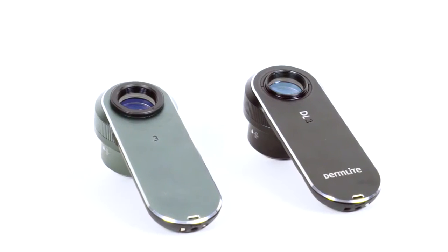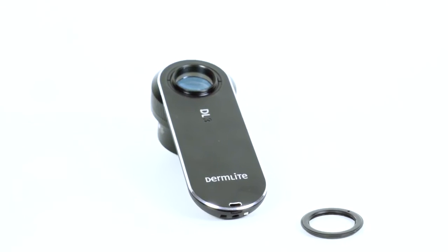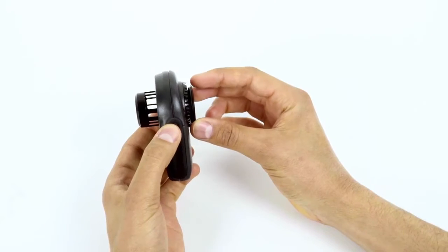Both the DermLight 2 and DermLight 3 dermatoscope series require the Magnetic Connect attachment. To attach, thread the Magnetic Connect ring to the front faceplate.